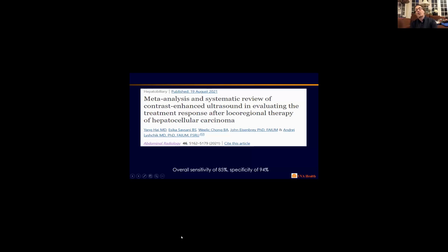That's fascinating. I know that this has been advanced more in the Eastern Hemisphere than in the US, as in some institutions it is a more routine tool for assessing post-intraarterial therapy response. Dr. Miller, any chance that this is going to make it into the criteria that are being worked on? Is this even on the table? The pictures are very compelling. Yeah, it's beautiful. And I know a lot of people who've also donated slides, and they're huge advocates, obviously. So I think it will certainly play a role.